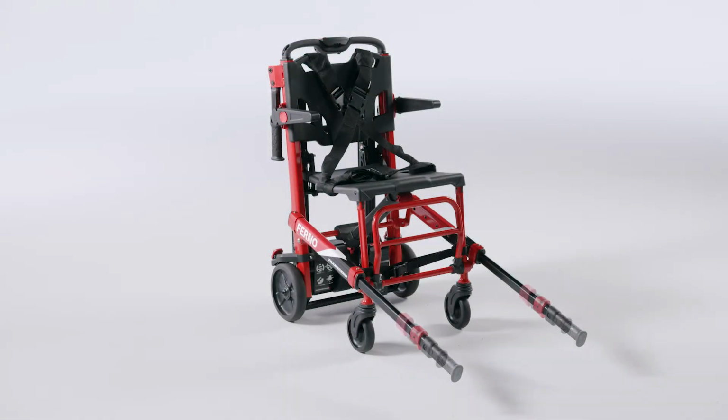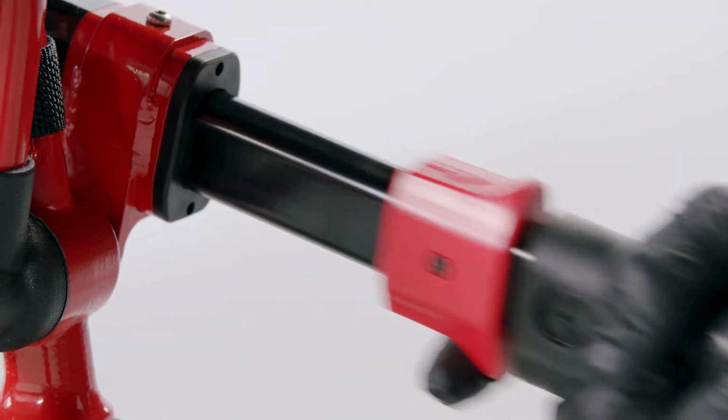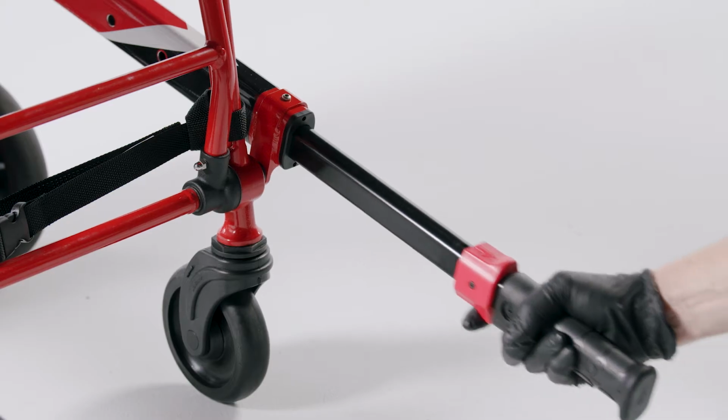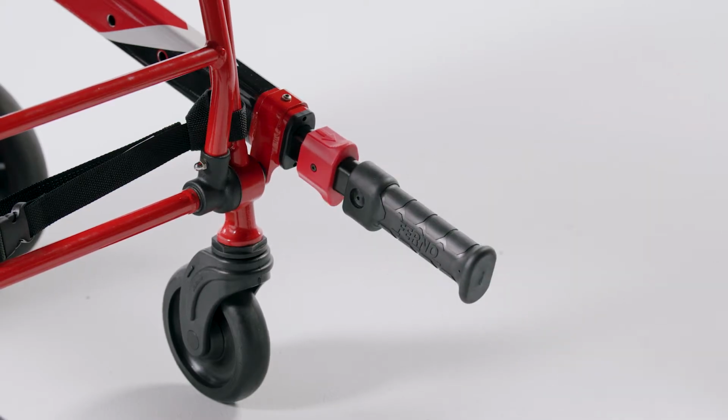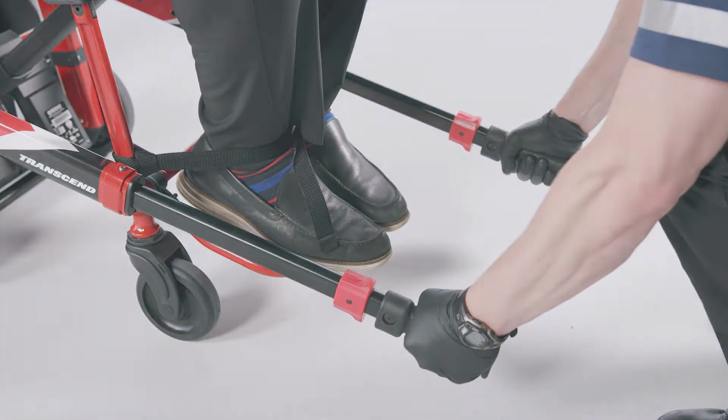The telescoping lift handles adjust to 5 locked positions. To change its position, pull the trigger and push or pull the handle near the desired stopping point. Release the trigger and slide the handle until it locks into position.